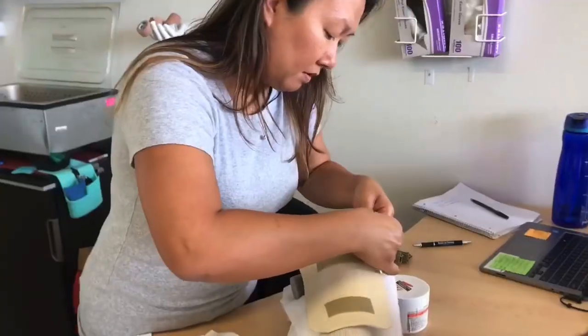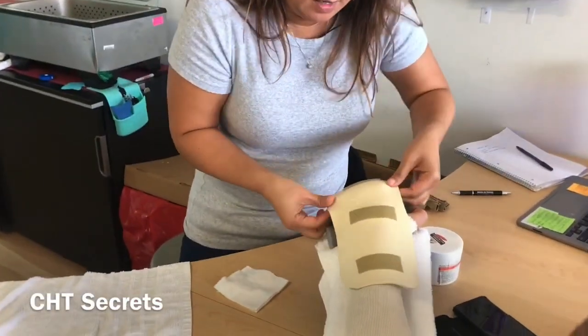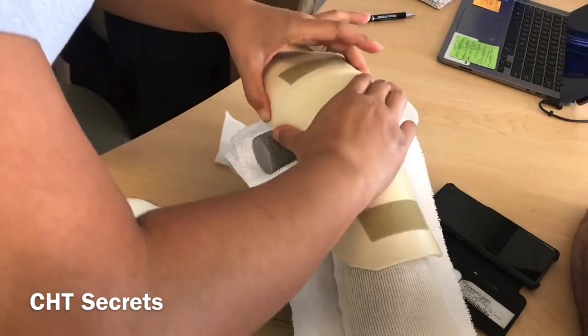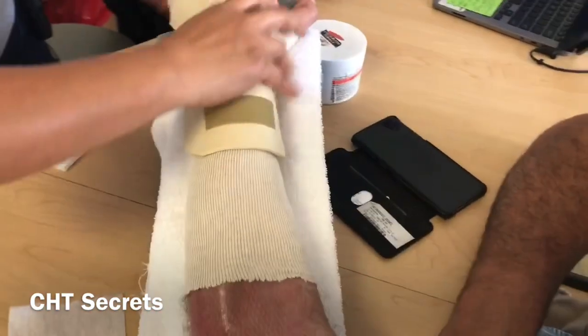All right, let's try. I'm going to pinch the sides and then I'm going to stretch it out. That way it's going to give me a little bit better coverage.